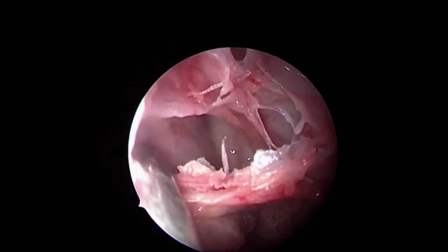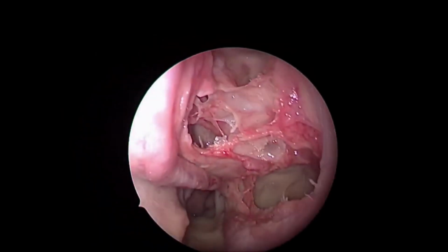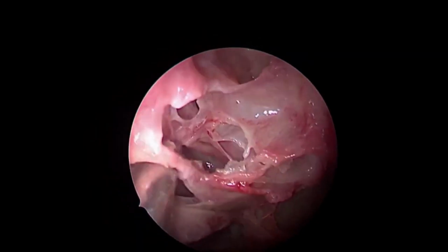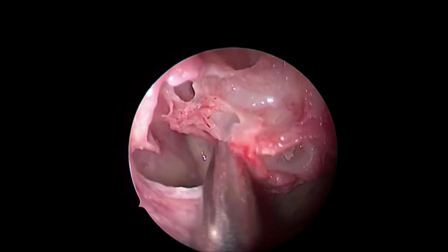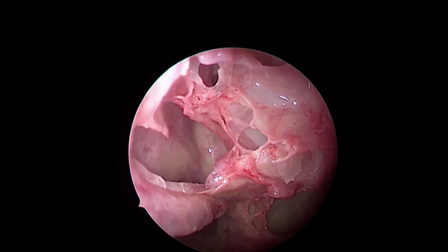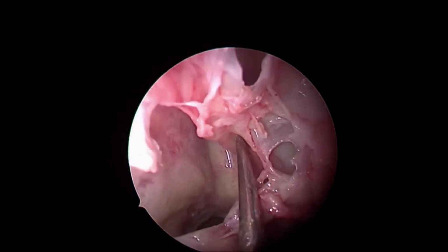So, I went medially through this opening into this medial part of the region. Can you see this? Now let me go more medially. I don't intend to do any sinus surgery or the posterior ethmoidectomy at this point unless I find some landmark. See this. For you, I am broadening this approach to show you. Can you see the superior turbinate behind? See this opening, I enlarged it so that you can see it better. This is your superior turbinate behind.